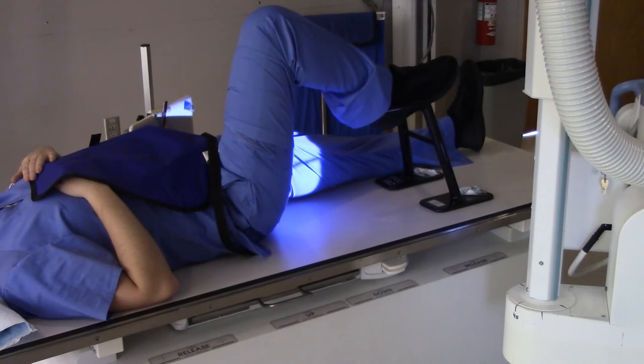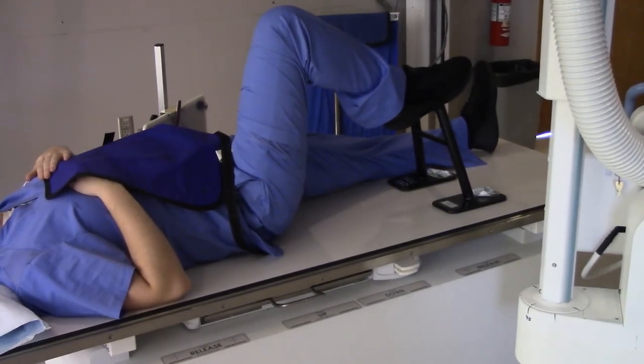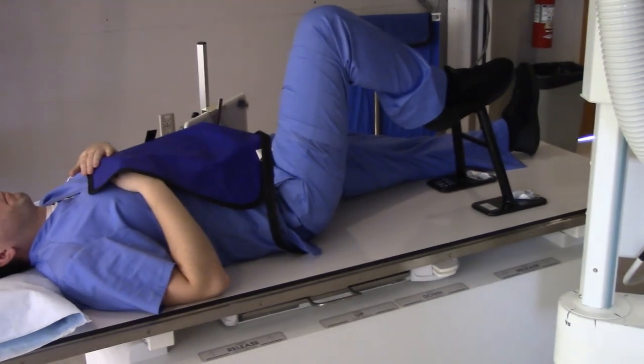Now all we're going to do is just have the patient hold still. Hold still. Beep. All right. Success. Kapla.